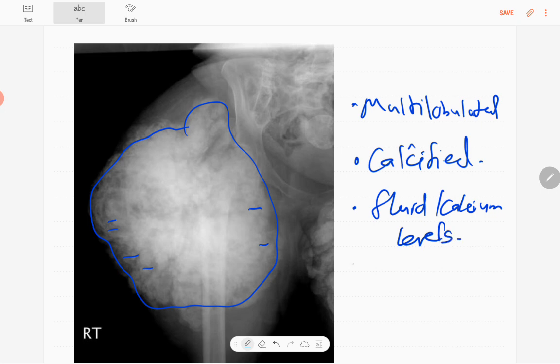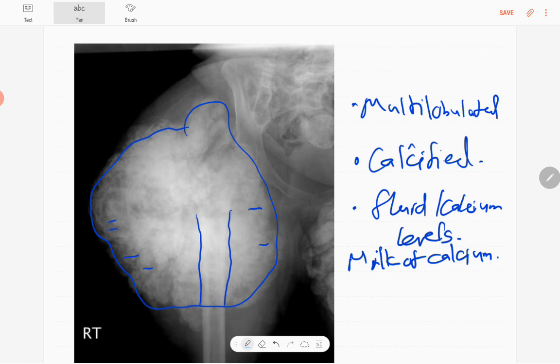These fluid calcium levels are also known as milk of calcium. The underlying bone is apparently normal with no obvious pathology — the cortex is intact. The hip joint is relatively unremarkable with no obvious fractures, and the visualized right hip bone is normal. There is no periosteal reaction in this region.